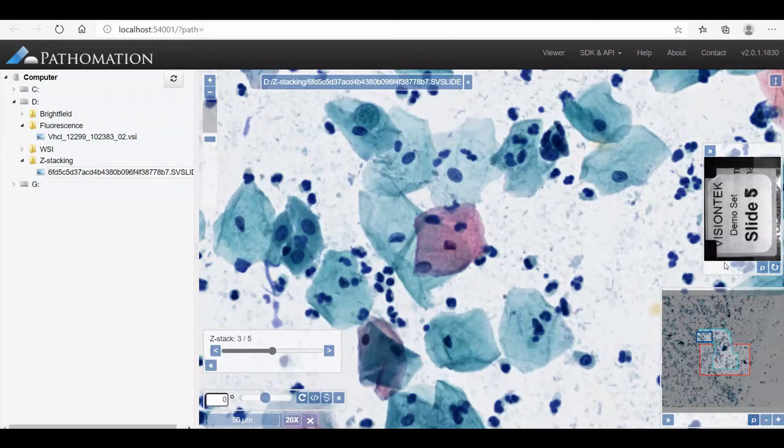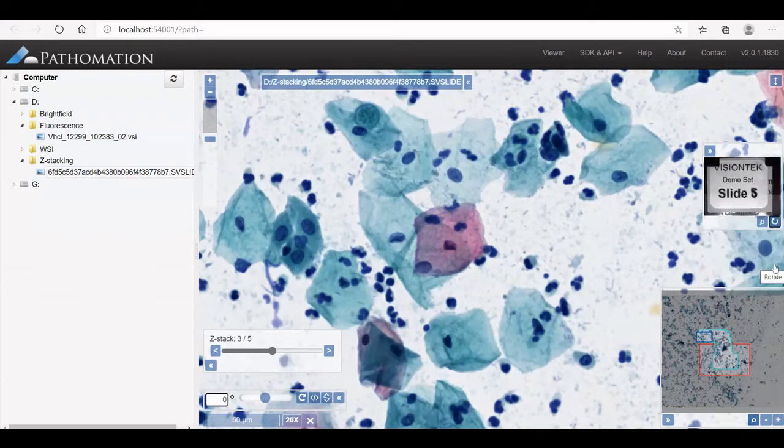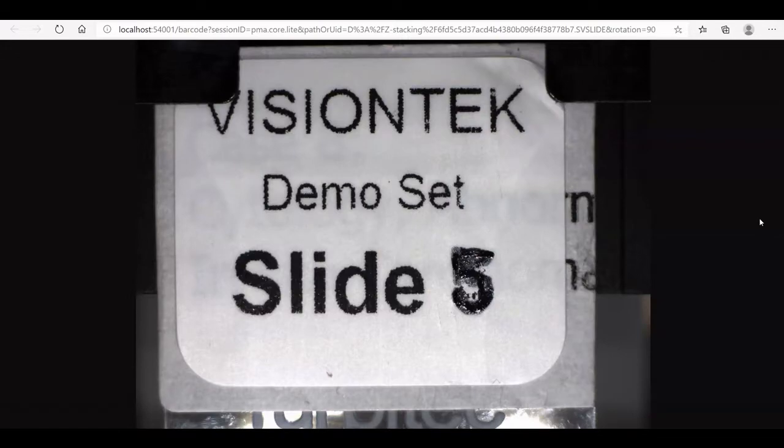You can rotate the barcode, and if the text is written very small, you can go full screen and set rotation.